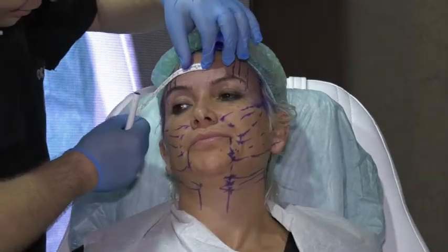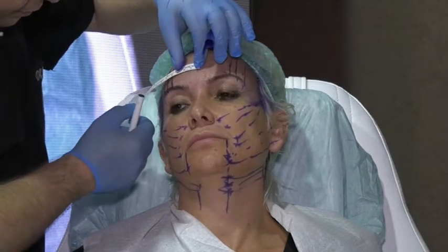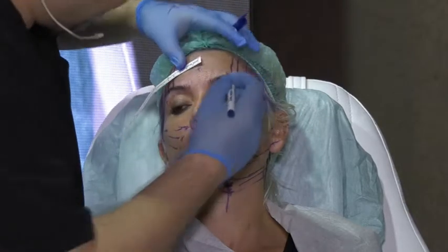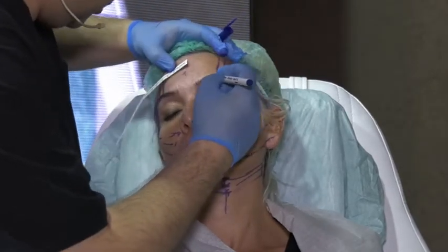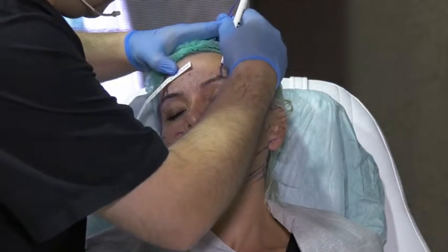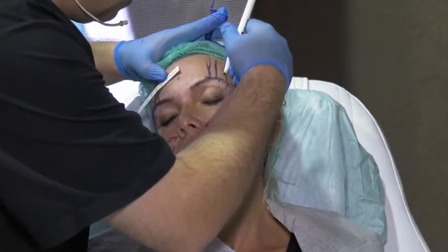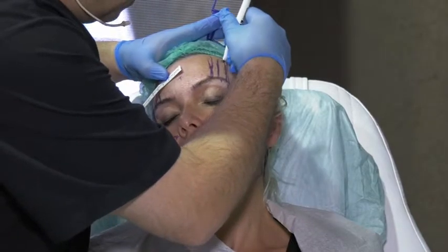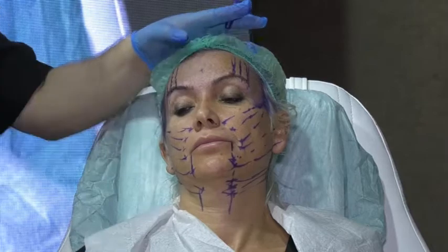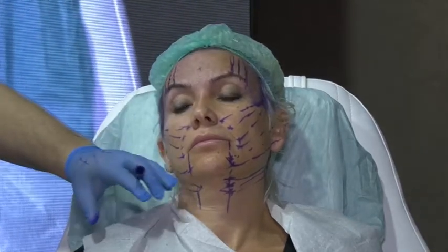Here is 4. Almost the same, so it's no big deal. Okay, I think I should go a little more with this one, like that. Okay. So I put 3 and 3, 3 and 3, 1, 1, 1.